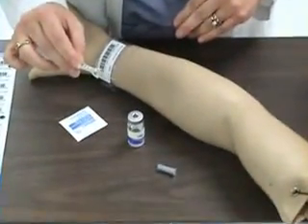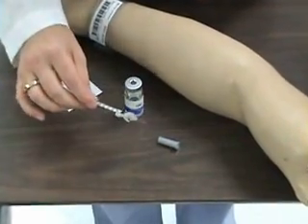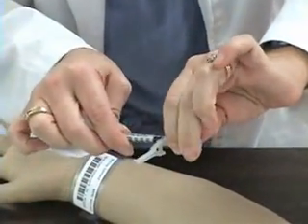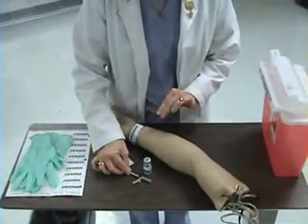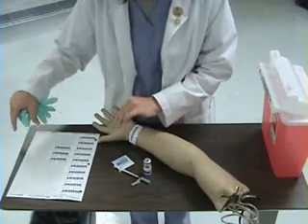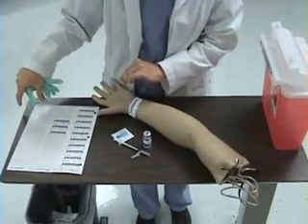At this point, I'm going to recap my syringe. I will scoop the cap and, with my fingers on the side, recap my syringe. I will then place a label on the syringe to identify the medication. On the label, I need to include the medication, the dose, and the route.